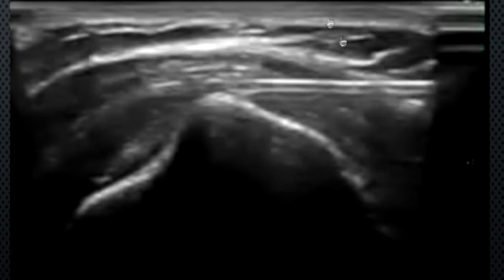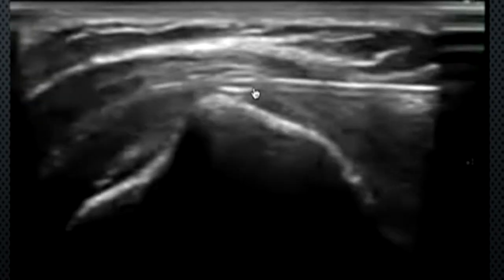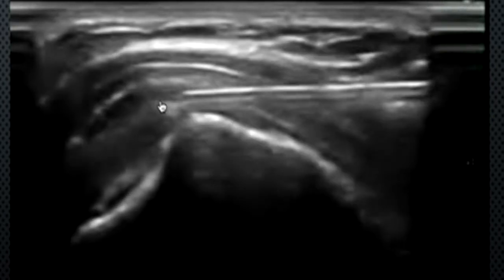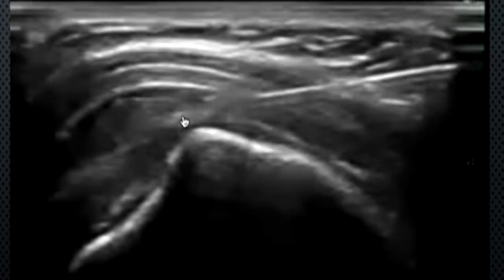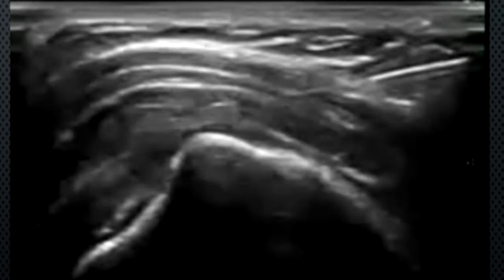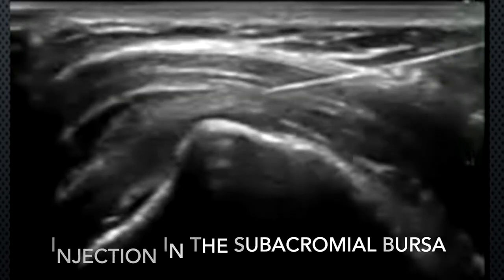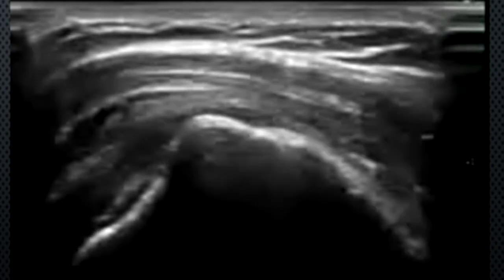What orthopedic surgeons typically do in blind injections is hit the greater tuberosity, since the bursa extends almost all the way up. Once confirmed within the bursa, inject the whole dose, then come out, apply a small bandaid, and give the patient the necessary instructions.